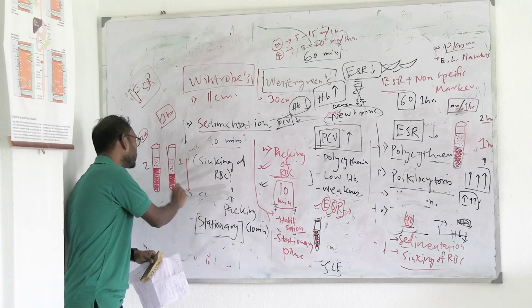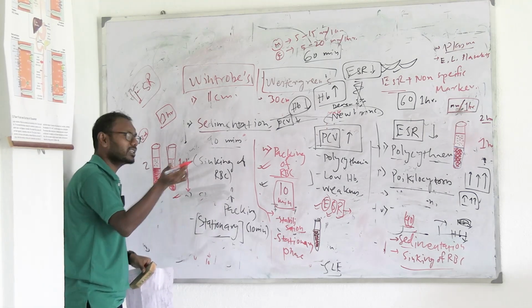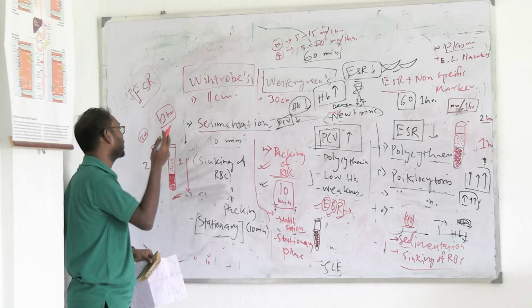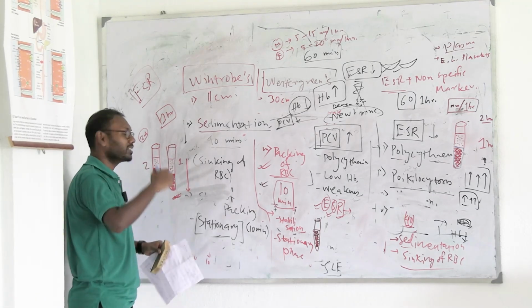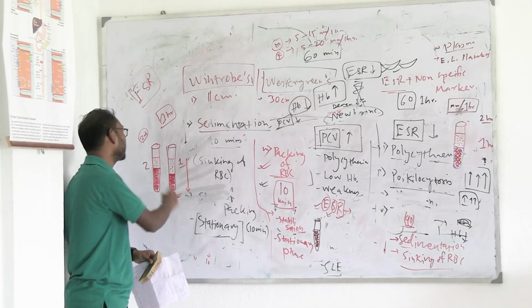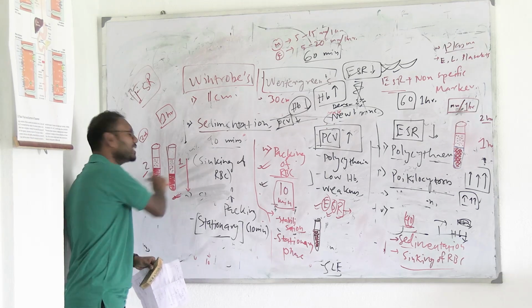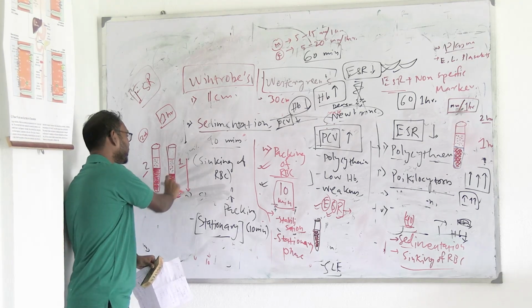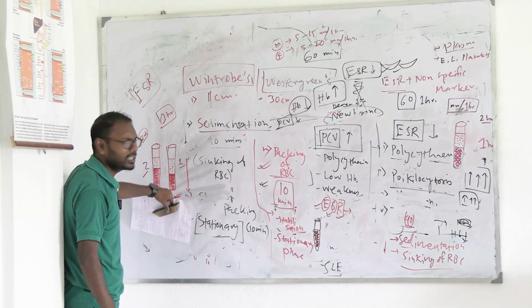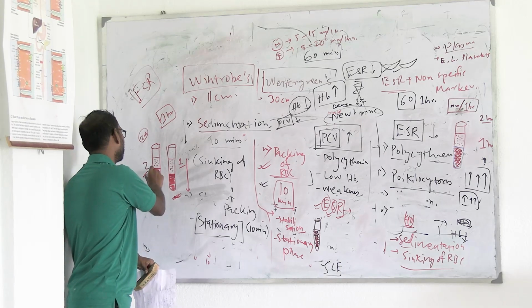This person, because these cells are more closely packed. So the sedimentation is better in this case. We will say after 1 hour, person 1 has a higher sedimentation rate than person 2, because his cells are better sedimented and better packed. The sinking has been better in this case.